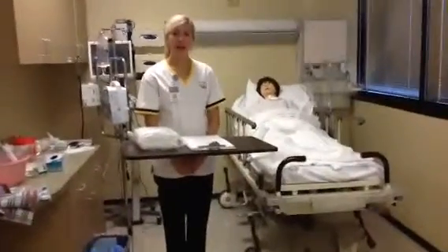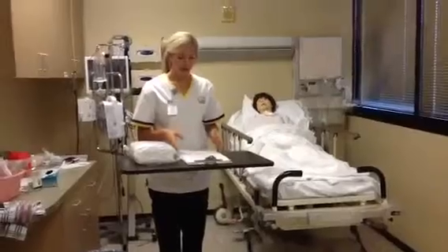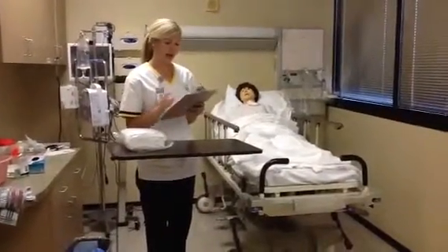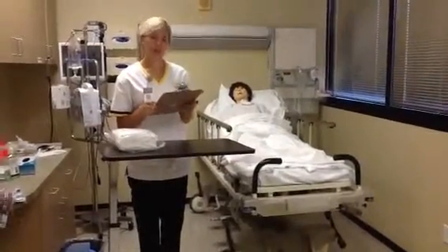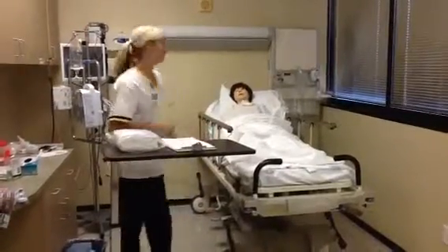I will be performing Foley catheter insertion. So to begin, I'm going to look at my provider's orders, and I see that Mrs. Charlene Knight has an order for Foley catheter insertion because of urinary retention, and she's been unable to urinate. So now that I've checked that, I'm going to go ahead and talk to the patient.